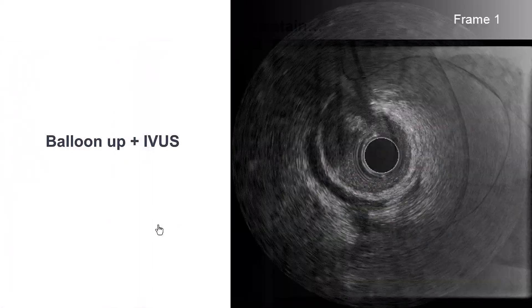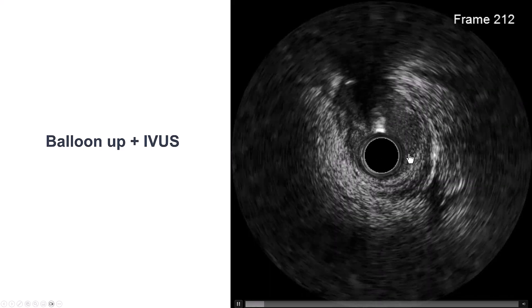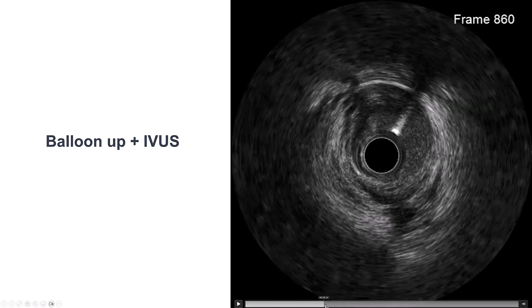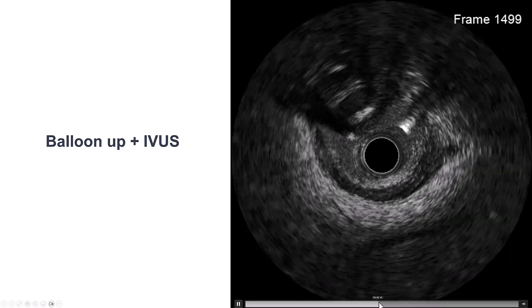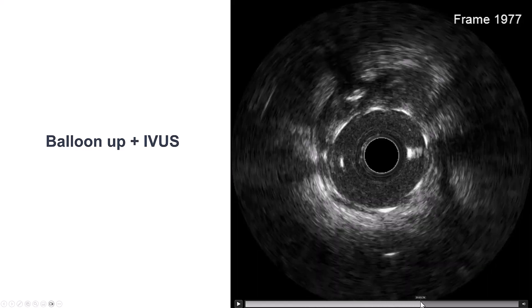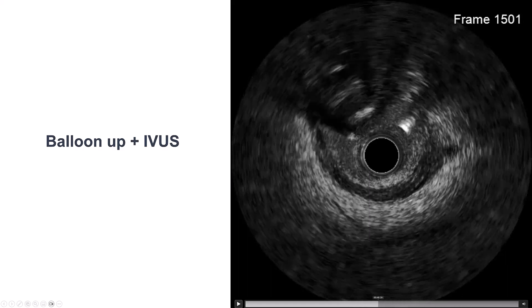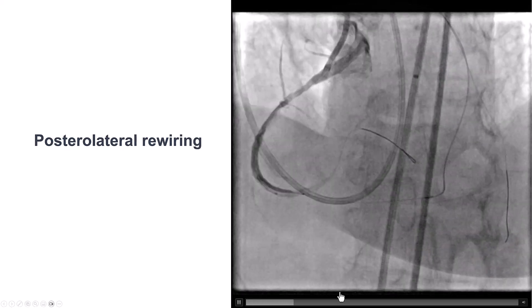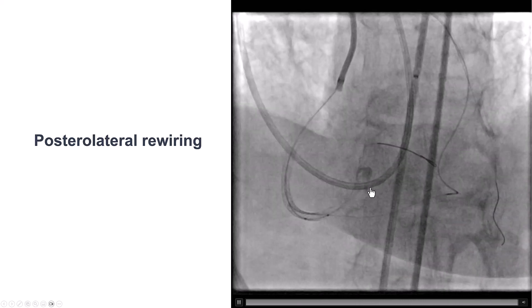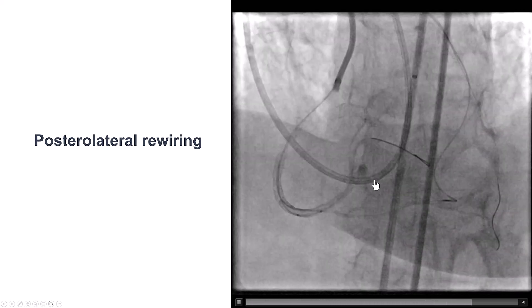So what to do about this? The first step was to place a balloon in the branch to stop the flow. We then performed intravascular ultrasound to see where we were — it showed we were into the lumen more proximal. The wire goes into the side branch, and when we come more proximal, we see the stent is well expanded. This issue is distal to the stent. We did prolonged balloon inflations and repeat injection, but unfortunately the stain was still there. Echo showed no pericardial effusion.